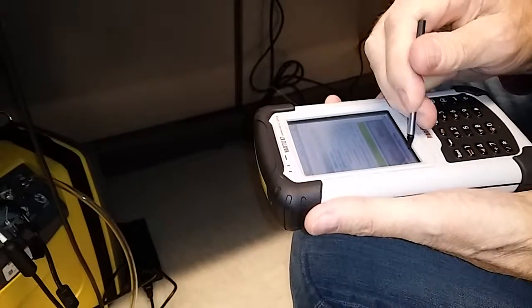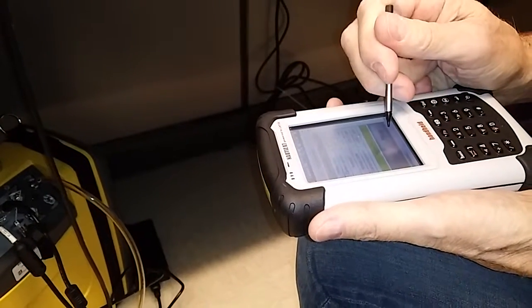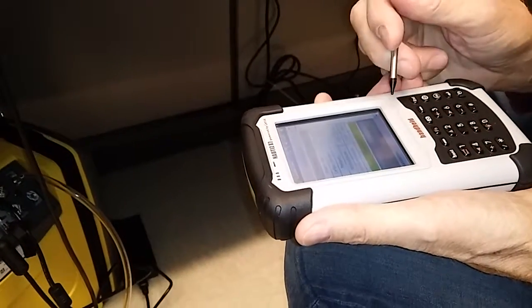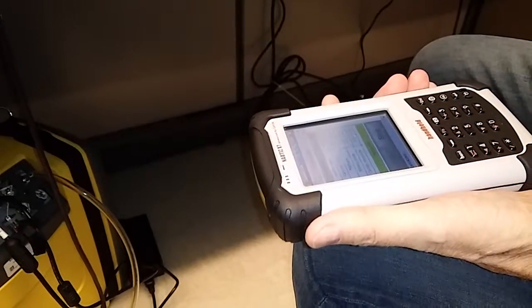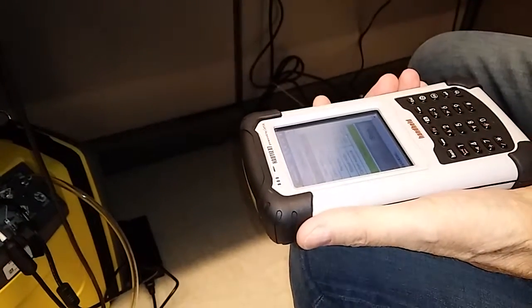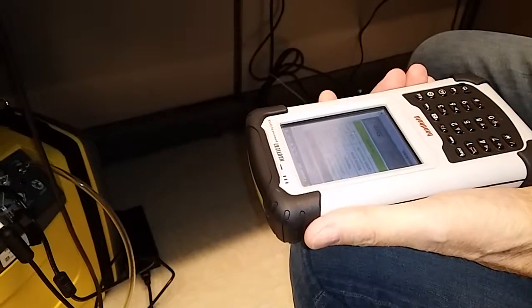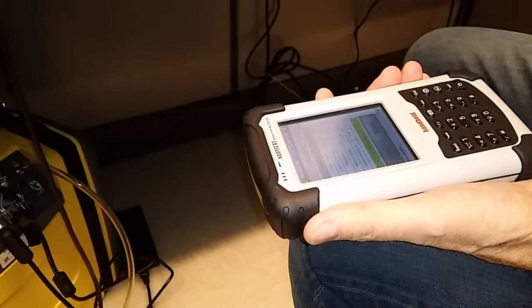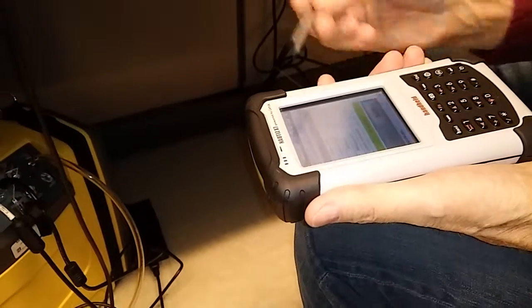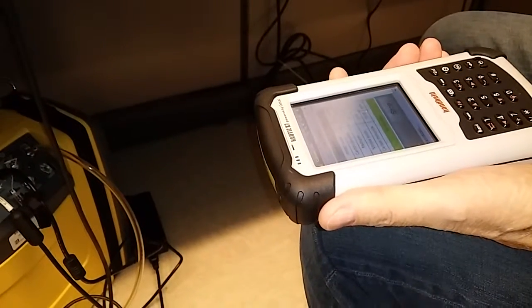Anyway, so let's go back to measure. Let's do another zero cal on it. And it's measuring, so it's doing another zero cal. I guess I have the heater on. You can't hear the fan going because every time it samples, the fan should be on. Measuring and showing how far it's gone.